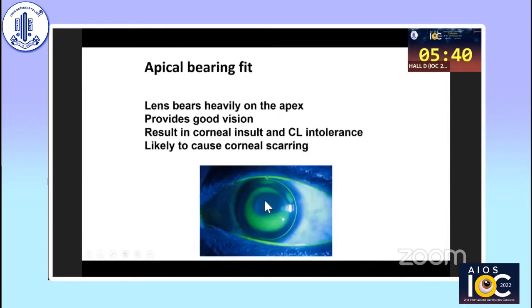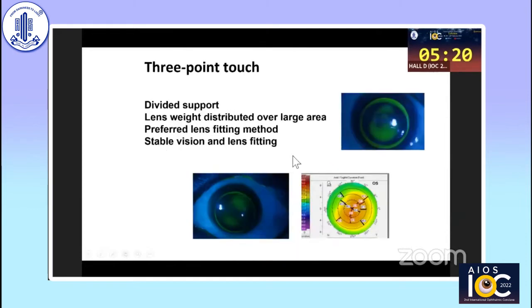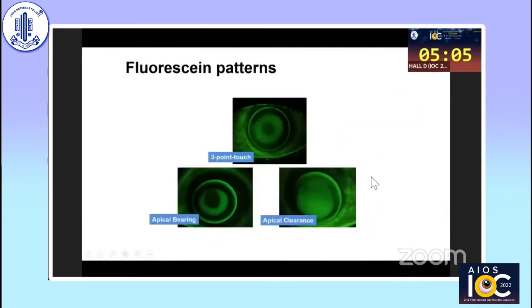Apical bearing is not an ideal fit and should not be prescribed. As seen in the fluorescein pattern, there is no fluorescein at the apex, meaning the lens is bearing heavily on it. It may provide good vision but will result in corneal insult, contact lens intolerance, and can lead to corneal scarring. Three-point touch is the ideal fit — the lens is placed on the corneal surface with weight distributed over a larger area, achieving stable vision. These three patterns are: three-point touch, apical bearing, and apical clearance.